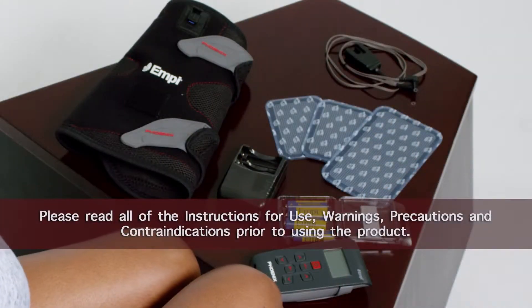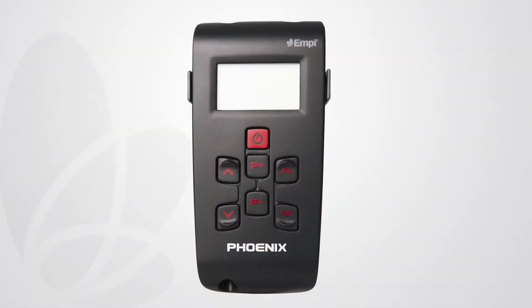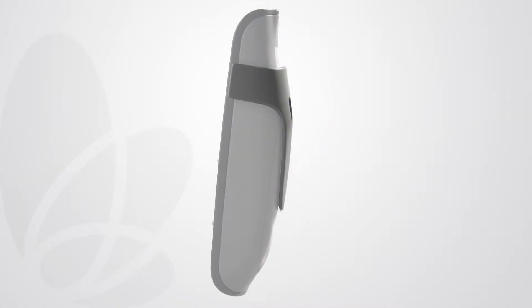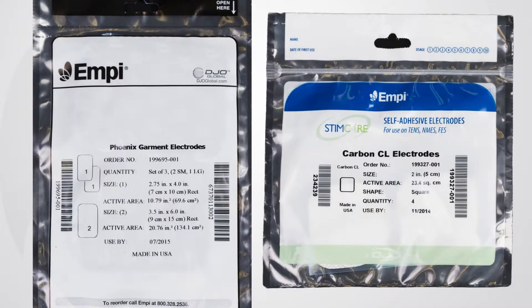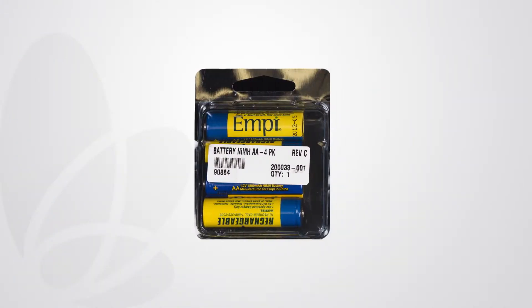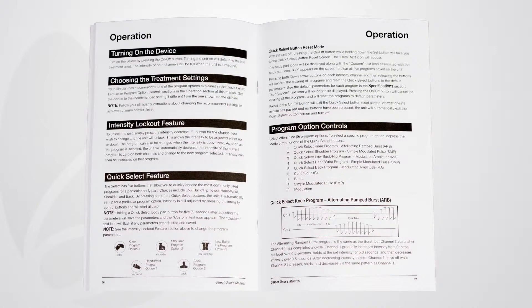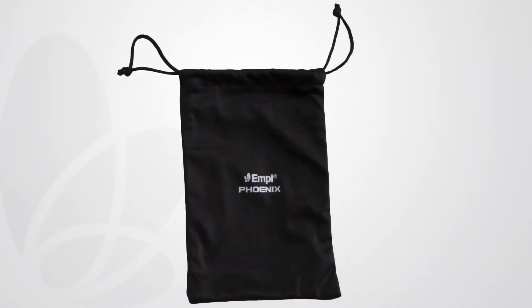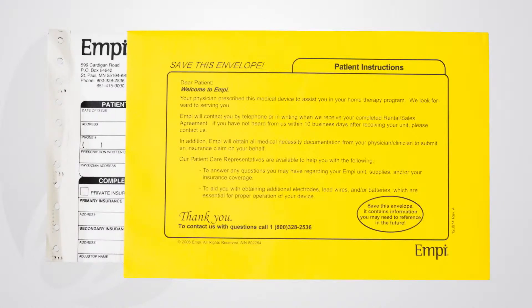To begin using the Empi Phoenix, remove all components from the box. Included in the box is the Phoenix device, a belt clip for the device, two lead wires, two packages of electrodes, batteries, a battery charger, the device's instructions for use, a soft case for the device, and an envelope titled patient information.